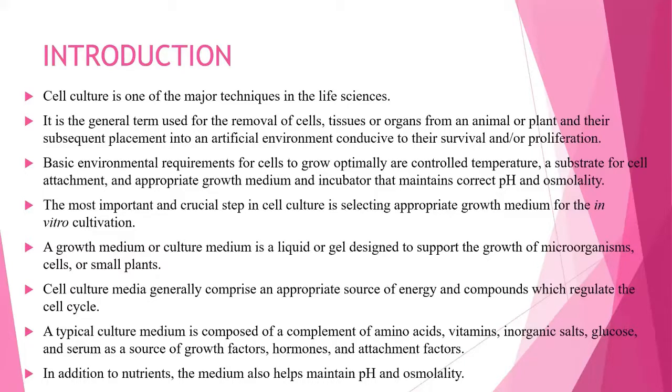Growth medium or culture medium is that liquid which we saw even in the video I showed last week. We saw how they added the powder to sterilized water and mixed it to get your pink colored solution. That is the cell culture medium. It is mostly red in color because of the phenol red present in it, which is a pH indicator. These cell culture media mainly provide the required energy for all the cells to grow and to enter into their cell cycle.